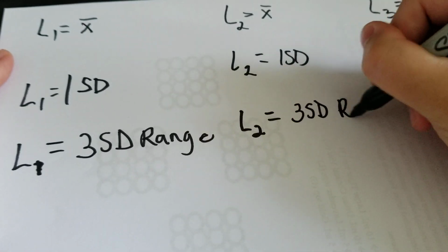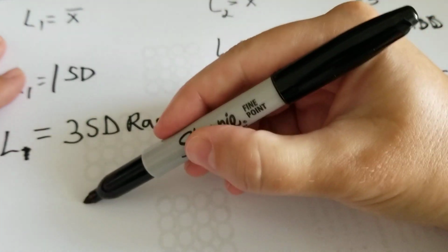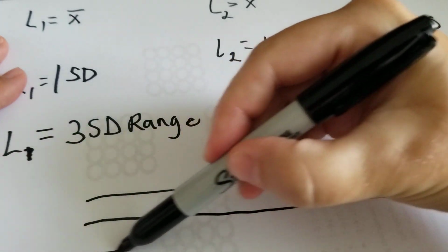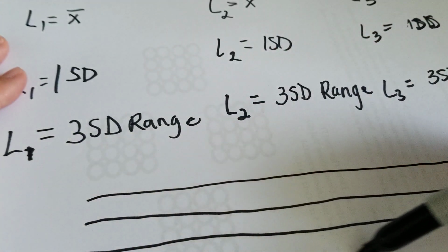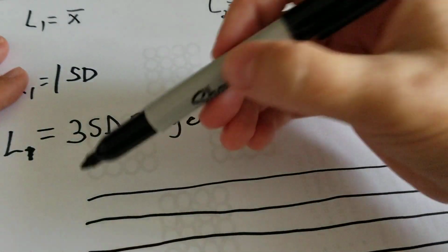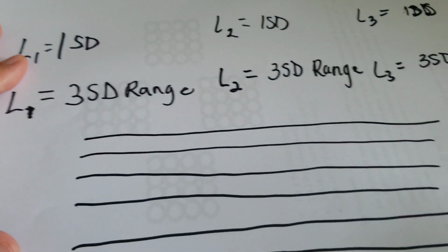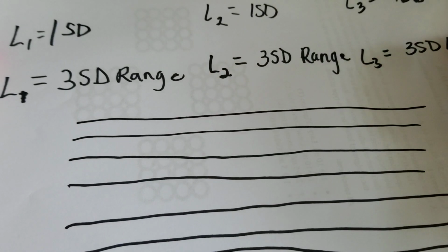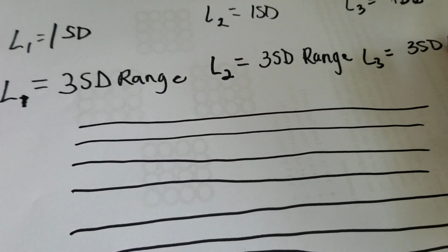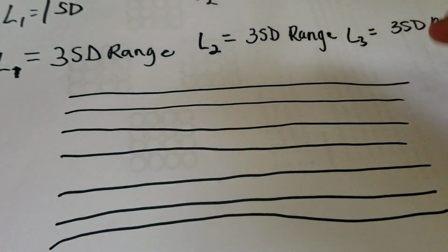Okay, so what does this all mean and how do we do it? How this all comes together is what is called the Levy-Jennings chart. Okay, and what that really is just a plot, a line plot of where the QC actually falls within the acceptable range, and basically plotting out what the acceptable range is.